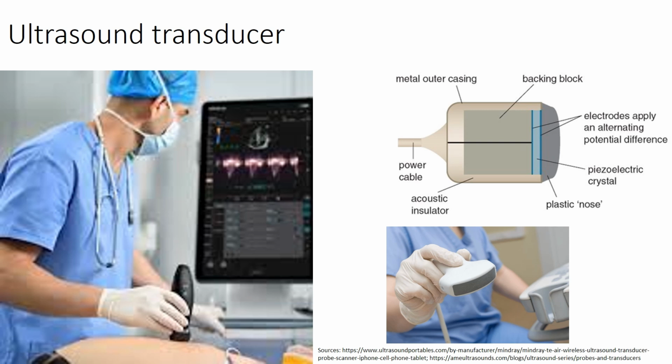This technique is non-invasive and very accurate, with measurements taken that can be used by the cardiologist to diagnose abnormal structures or functions in the heart and major blood vessels. And this is where we apply the Doppler effect.